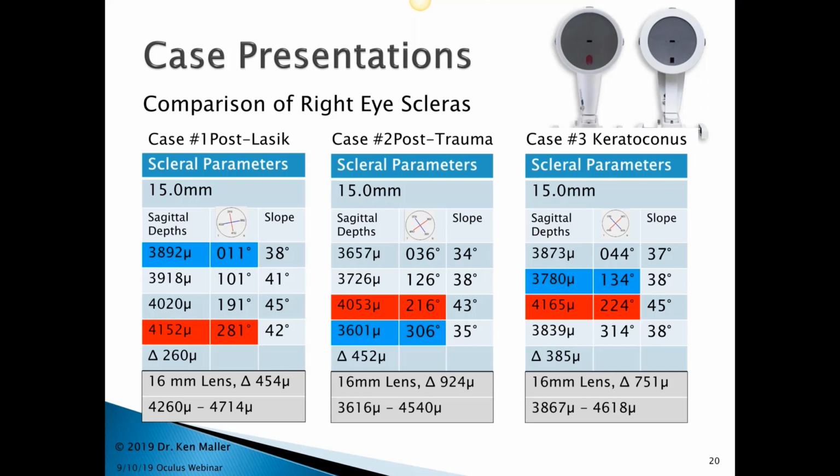But think about how tough that is on an eye or a pair of eyes that has tear film problems and you're trying to capture data. I would imagine that may lengthen it considerably. I'll also point out that in my early days, when I was trying to do this with only 2 hands, I spent as much as 25 minutes trying to get data, and I still did not get good data.